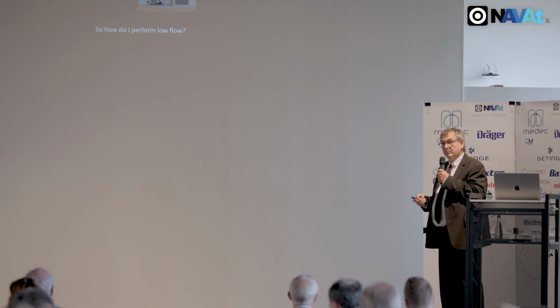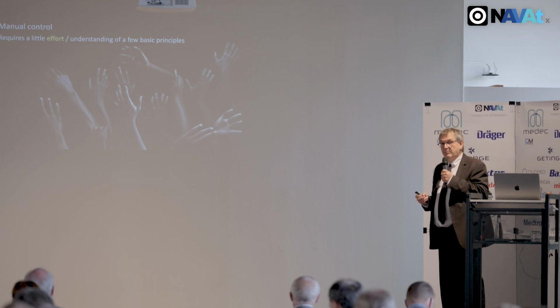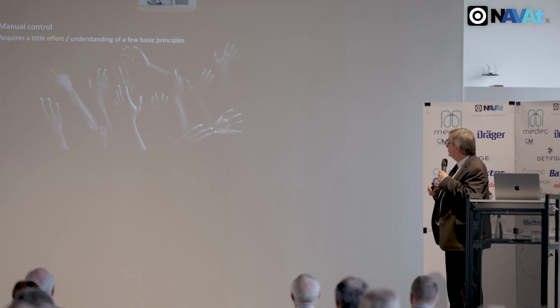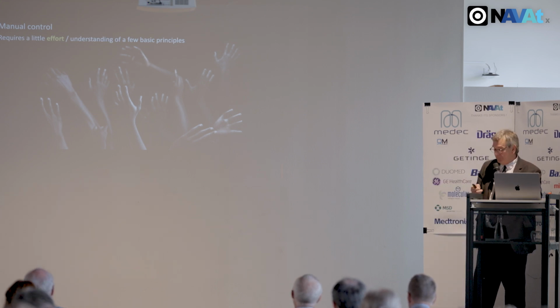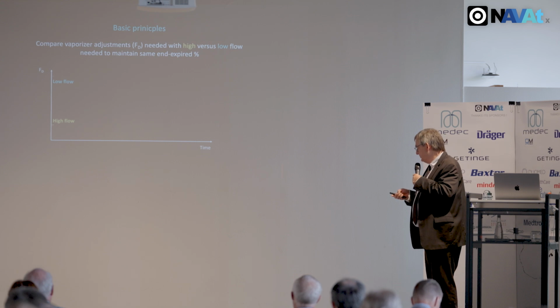So how do I perform low flow? Well, first let's consider manual control, where you are going to control the vaporizer and the fresh gas flow settings. It requires a little effort and understanding of a few basic principles. So what are these basic principles?